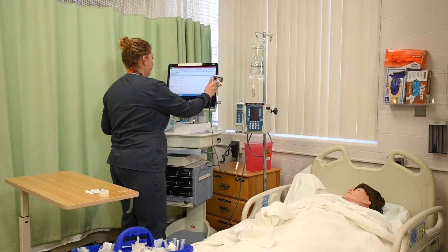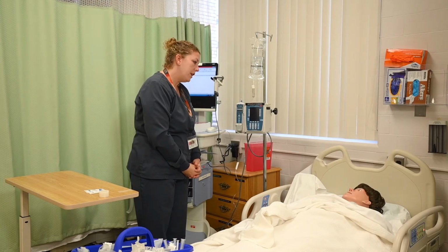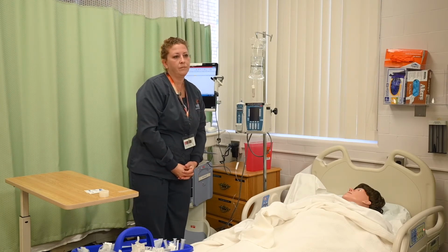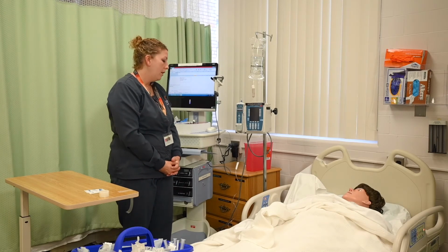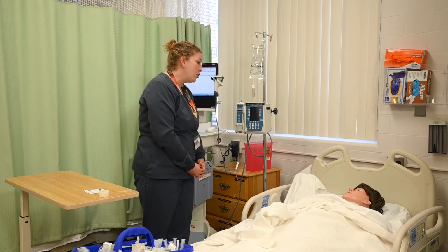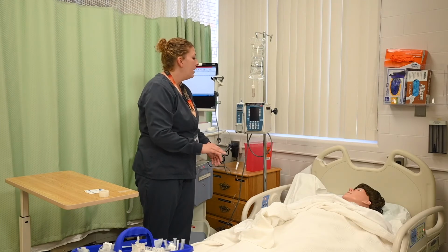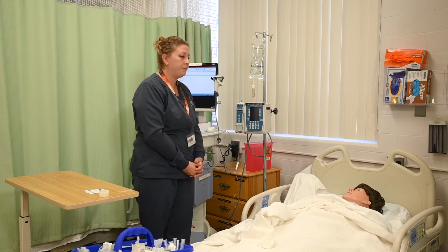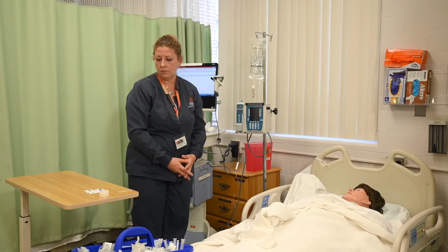Thank you. Verify patient allergies. And do you have any allergies? Okay, that won't affect our procedure today. Okay. Explain the procedure to the patient. Ivy, I have some good news. You're going to be discharged home today, so I have an order to remove your IV catheter. I'm just going to put some gauze on your arm and remove the tape and take the IV catheter out of your arm.